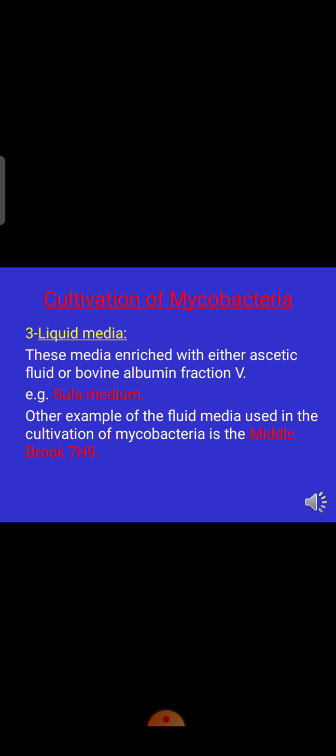Another culture media used for cultivation of mycobacteria is the liquid media. This media is enriched with either ascitic fluid or bovine albumin, like the Sula medium, or another example of the fluid media, the Middlebrook 7H9. These media are used as a backup and for performing the biochemical tests to identify the species of the isolated mycobacteria.